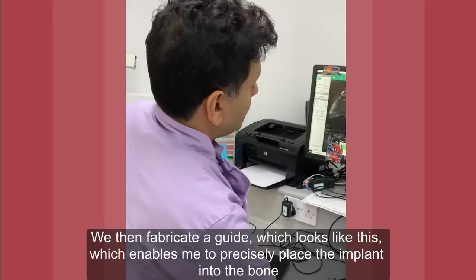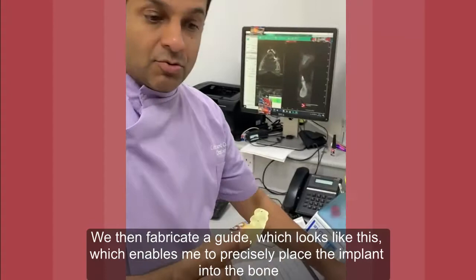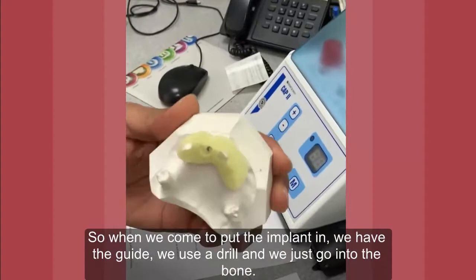What do we do next? We then fabricate a guide which looks like this, which enables me to precisely place the implant into the bone. When we come to put the implant in, we have the guide, we use a drill and we just go into the bone.